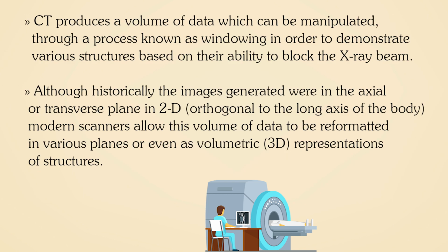Although historically the images generated were in the axial or transverse plane in 2 dimension, that is orthogonal to the long axis of the body, modern scanners allow this volume of data to be reformatted in various planes or even as volumetric 3-dimensional representations of structures.